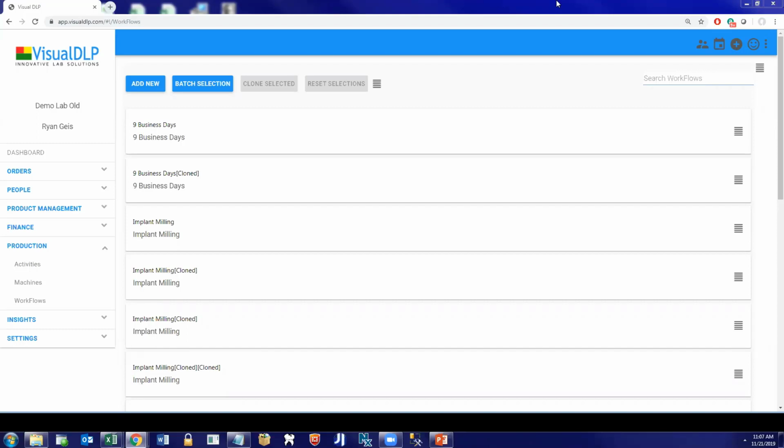is going to support this, because it may be a what if they're a Magic Touch lab and you want to share a case with a Magic Touch lab or a LabStar lab? We'd like to be able to support all of that, perhaps. So we're going to try to build this middle platform where we can share data. Sounds great. The first being EasyRx to VisualDLP, and then VisualDLP to VisualDLP, or VisualDLP to an EasyRx lab. Yeah, we'd totally like to support that.